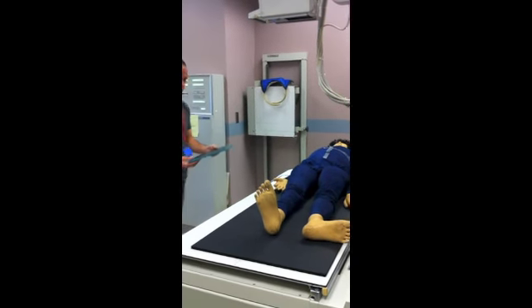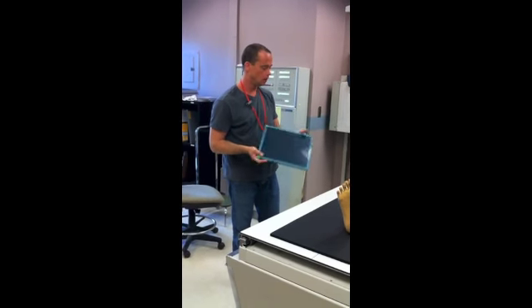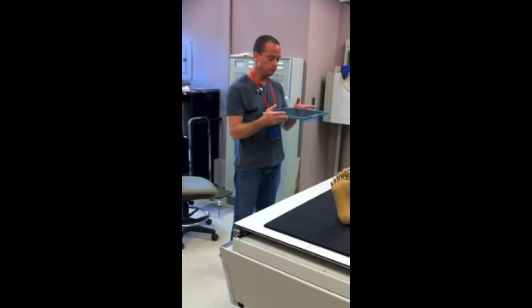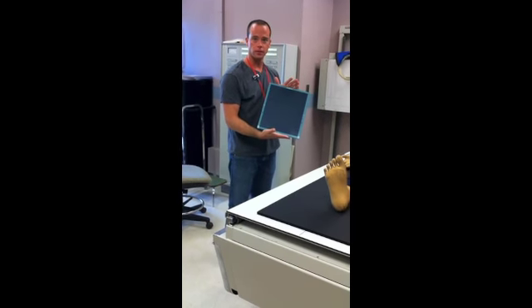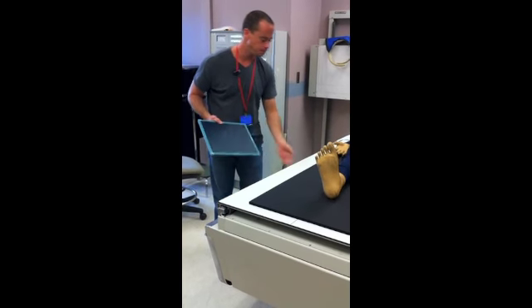We're going to be using a 10 by 12 plate. I'm going to put it in portrait and green bar toward the patient's head.